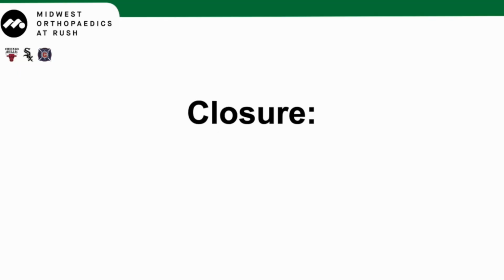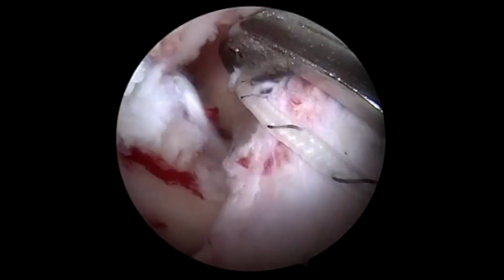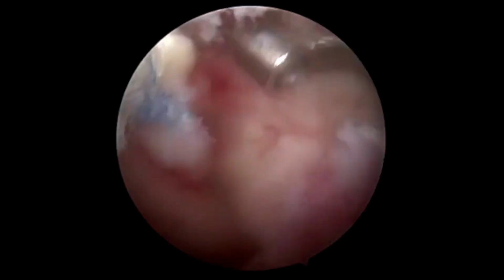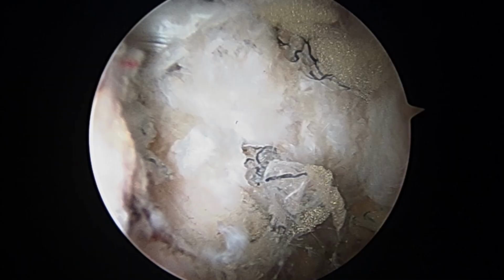Having completed our labral reconstruction, as well as our cam and pincer resections, capsular plication was then performed using a suture shuttling device and high tensile strength polyethylene sutures. Wounds are then closed with 3/0 Vicryl in the subcutaneous tissue and 2/0 Prolene in the skin. A postoperative brace is applied.